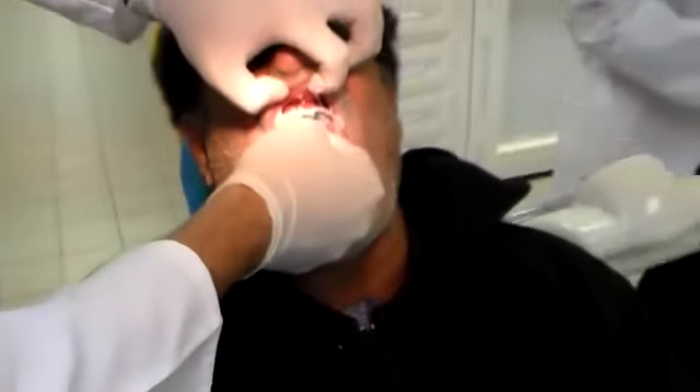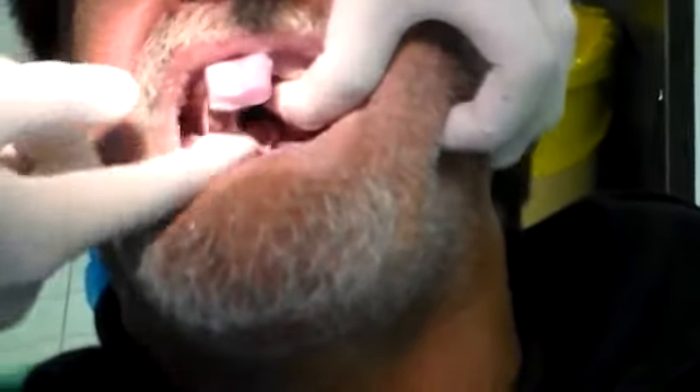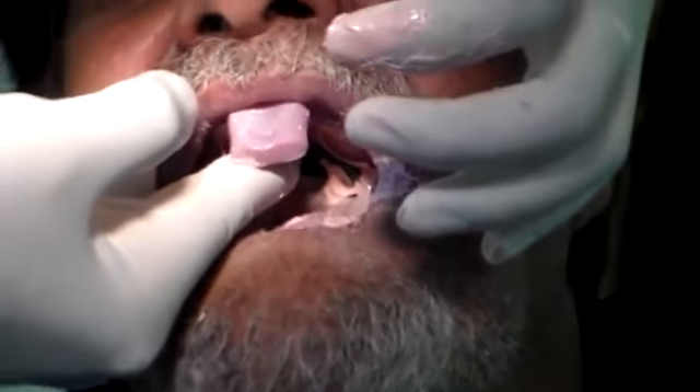I'm going to just place it into the patient's mouth, lift up the phrenum, make sure I got the phrenum position right. Place it into the patient's mouth. I have some material falling off — I want to scoop it onto the tray. Wait for a few seconds because the material will be flowing.